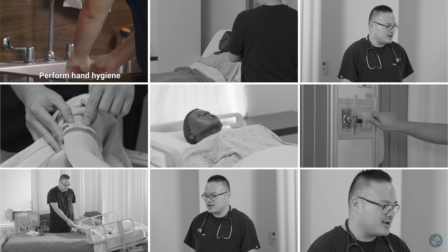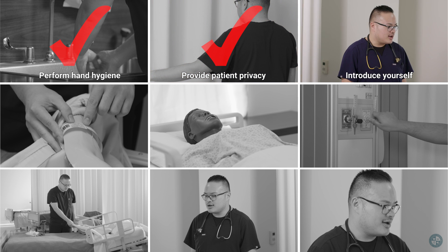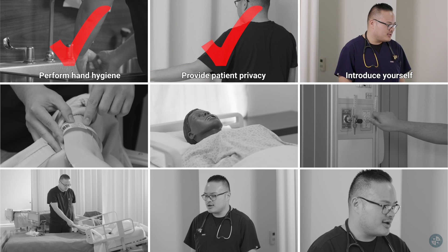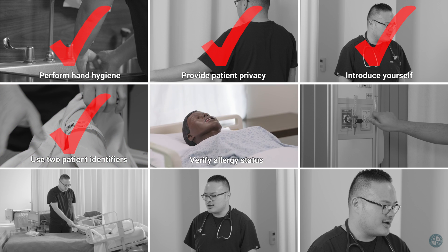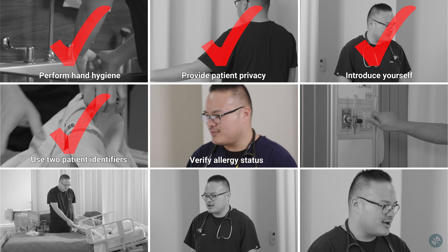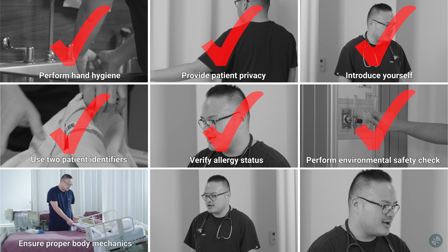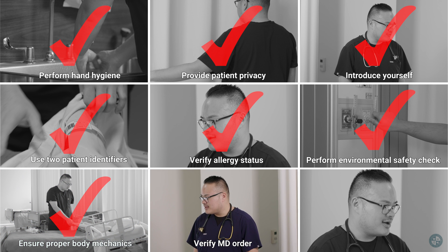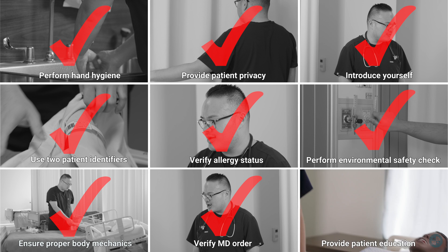Perform hand hygiene. Provide patient privacy. Introduce yourself. Use two patient identifiers. Verify allergy status. Perform environmental safety check. Ensure proper body mechanics. Verify MD order. Provide patient education.